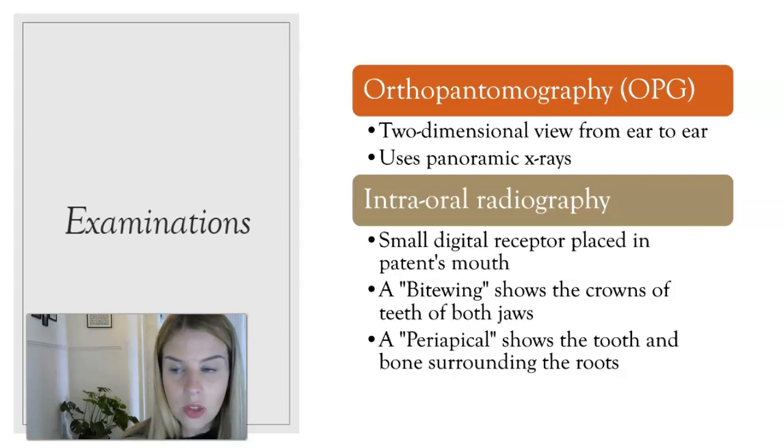So hopefully, because you're not getting to go to the dental hospital, this will give you a wee bit of an overview of some of the things that you might do. And obviously you don't just do these things, especially OPGs, you do them out in normal practice.